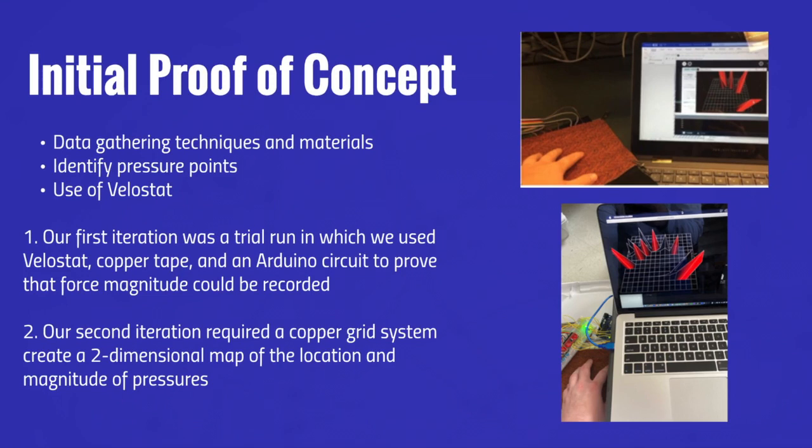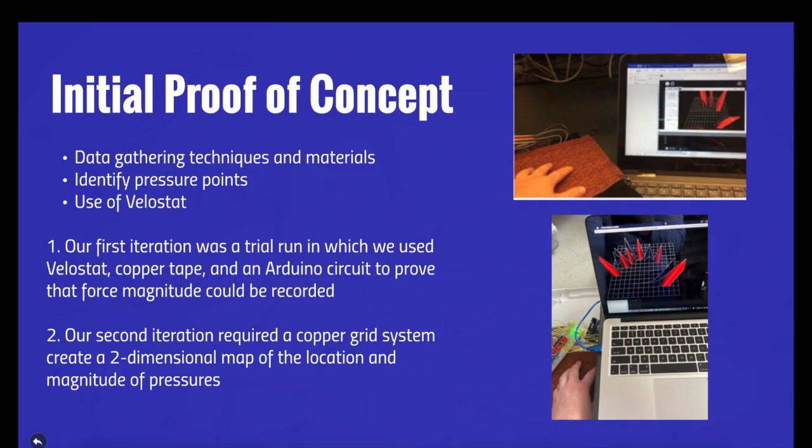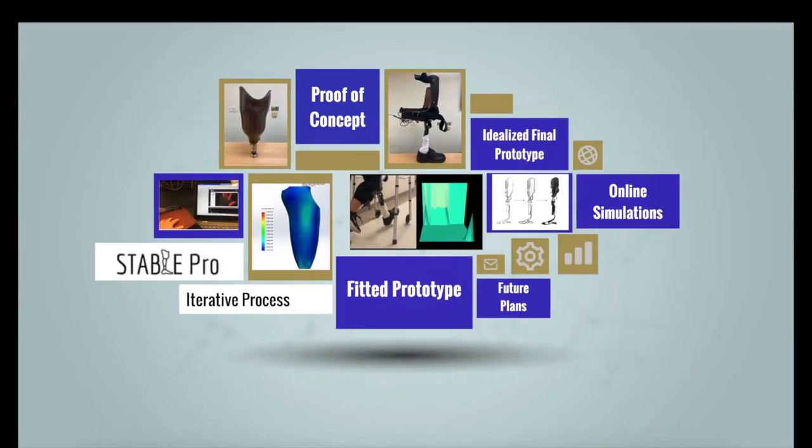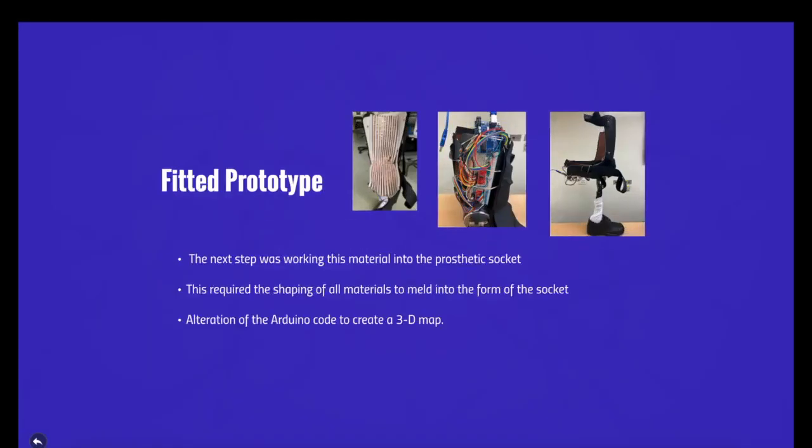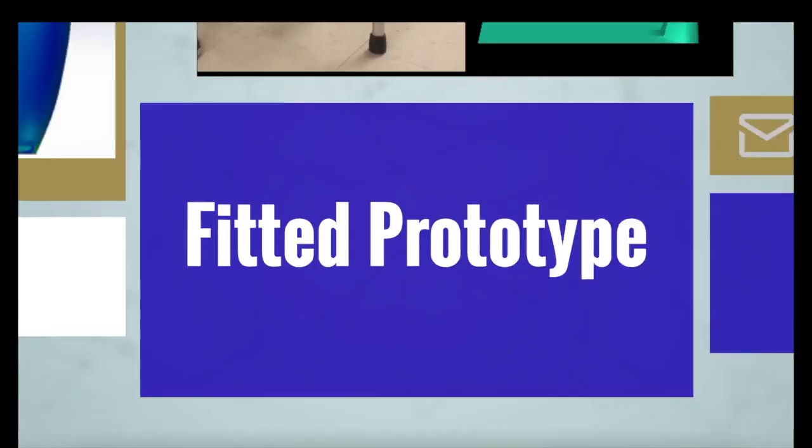Our first iteration was just a trial run in which we used Velostat, copper tape, and an Arduino circuit to prove that force magnitude could be recorded. Our second iteration required a copper grid system and an advanced Arduino code to create a two-dimensional map of the location and magnitude of pressures exerted upon the Velostat. The next step was converting this 2D surface into the 3D prosthetic. This required the shaping of all materials into the form of the socket, as well as the alteration of the Arduino code to create a 3D map.